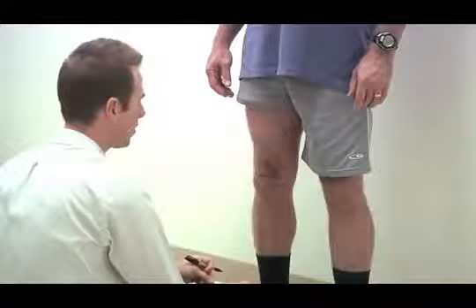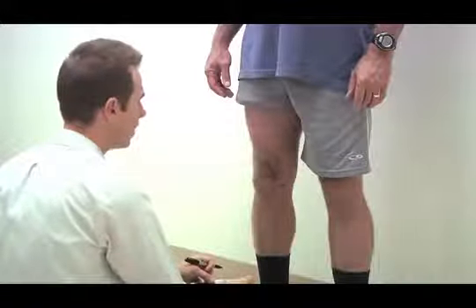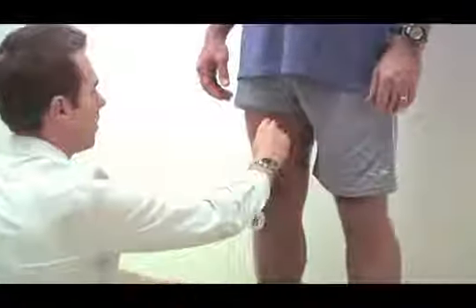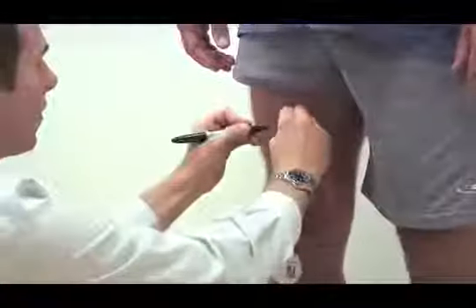If you're having a hard time finding the medial or lateral joint space, create a knee axis line by finding mid-patella. Next, we're going to find your 3 inches and 6 inches above and below your knee axis line. Start by marking 3 inches above and marking 6 inches above, as well as 3 inches below and 6 inches below.